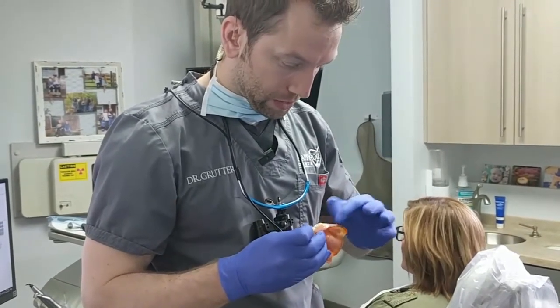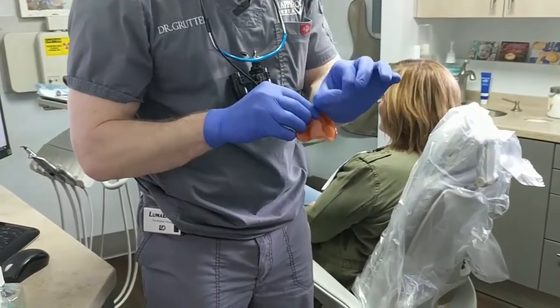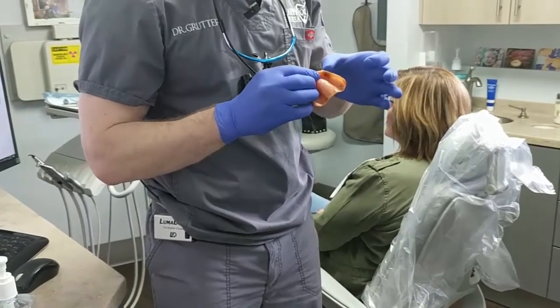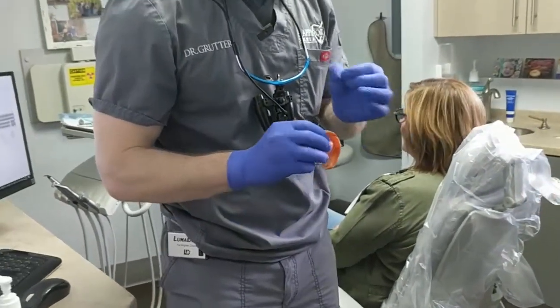They're just temporary — the patient's not going to leave with these adhered to them. It probably wouldn't be the worst thing to take some gauze with alcohol to really dry that off, but I don't have too much problem with them coming off, though I do know some people have.